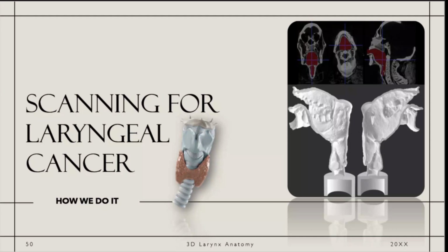And before continuing, this is a CT image of a mummy. They tried to replicate the 3D specimen of the laryngeal structures of a mummy. They tried to imagine what its voice was like. It was a very interesting experience. They tried to replicate the voice of a mummy.